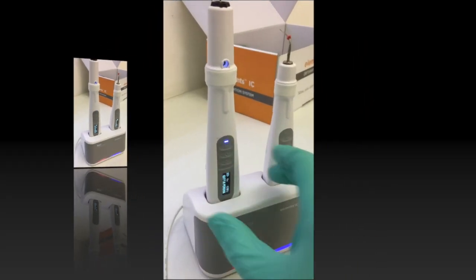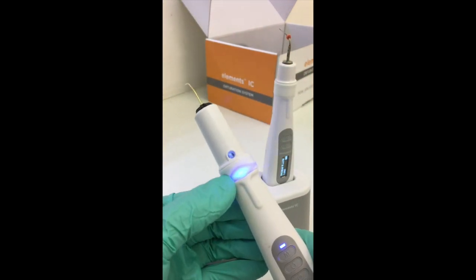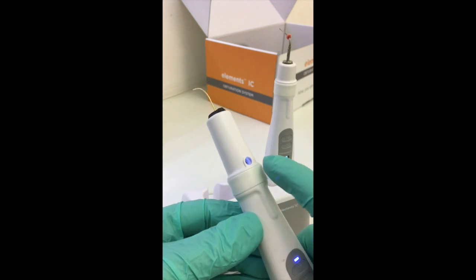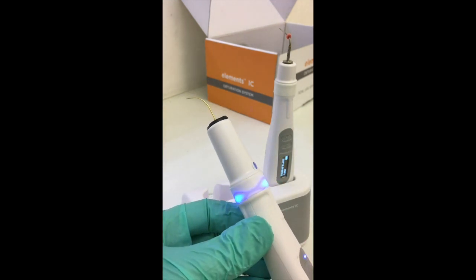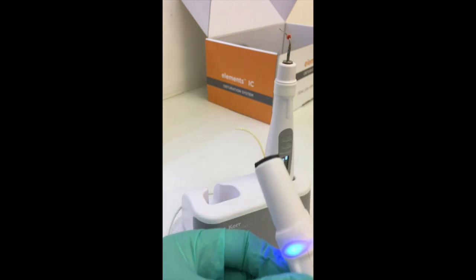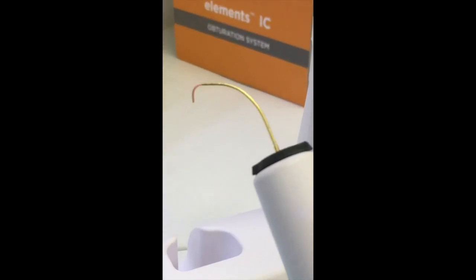This makes it very easy to operate within the clinical and oral environment, and it applies a very consistent and acceptable level of obturation through the preheated backfill cartridge. The light flashes to indicate that the unit is activated, and there we can see the thermoplasticised guttapercha extruded from the plugger tip.